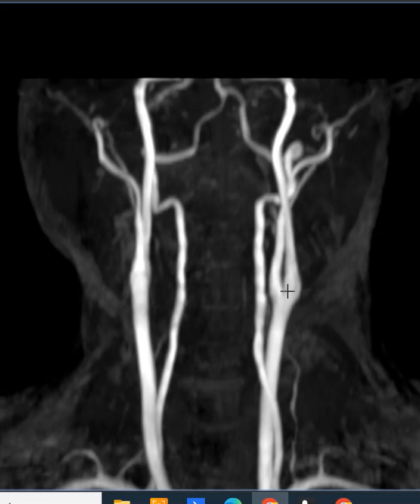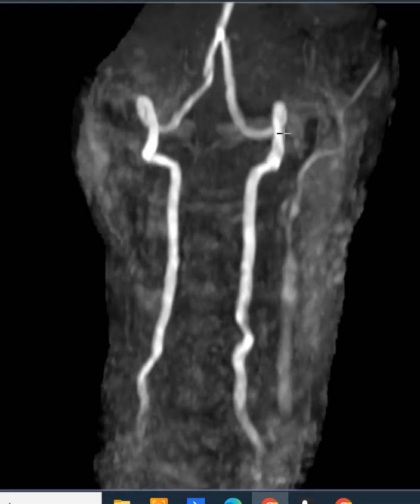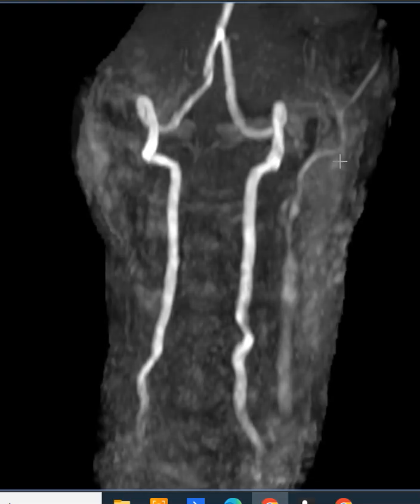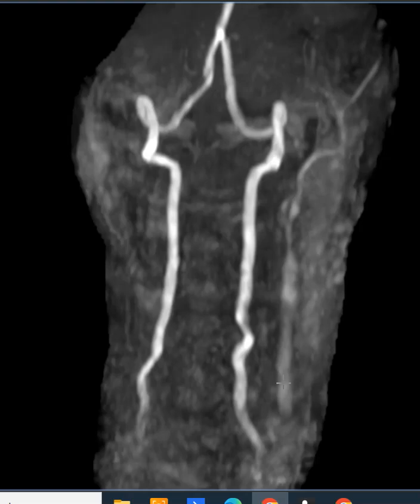So this is a normal appearance where the vertebral arteries and basilar arteries look great. Carotids look great. There's no stenosis or occlusion. And now another patient — this is their MRA of the neck, and it's pretty striking because there's something missing. We see the vertebral artery on the right and left. We see a little intimal flap here causing narrowing of the right distal vertebral artery. The left side looks good, this is their basilar up here, but there is no left carotid. There's a little faint flow in the left carotid here, and this is a little part of the external carotid artery — but really, occlusion of both carotid arteries.